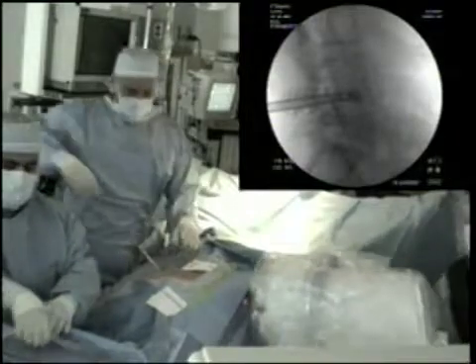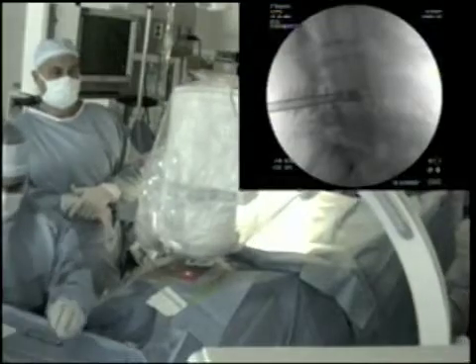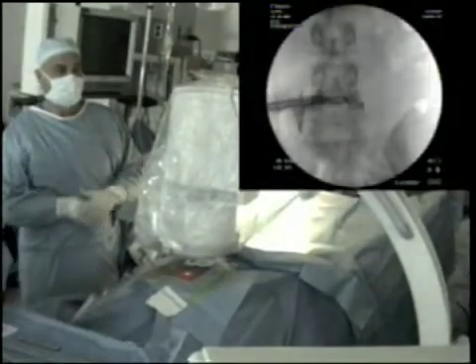AP and lateral fluoroscopic images enable appropriate positioning of the surgical instruments.